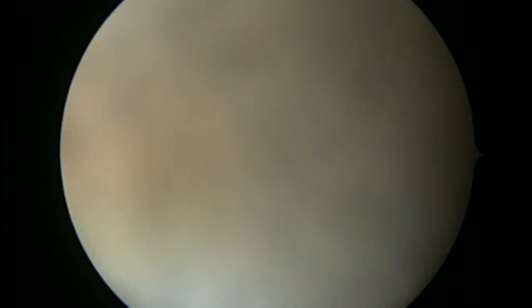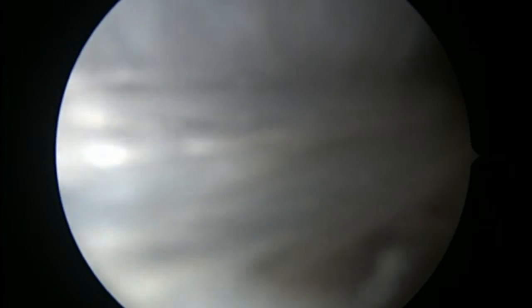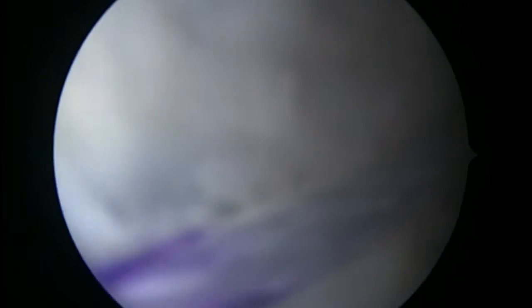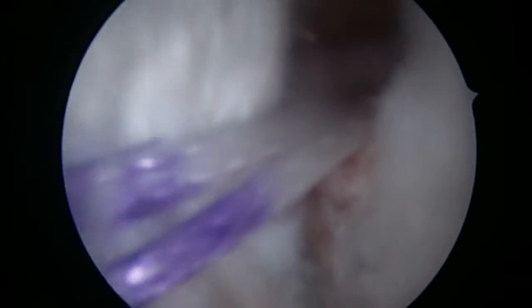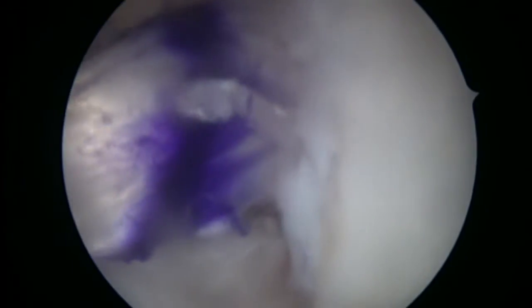You are able to walk the next day, and if you have a sedentary job you can resume it by three to four weeks. As you can see, with these threads we are pulling the graft into the hole. The graft is fed through the tibial hole and pulled arthroscopically into the femoral position. That white structure coming into view is the graft.